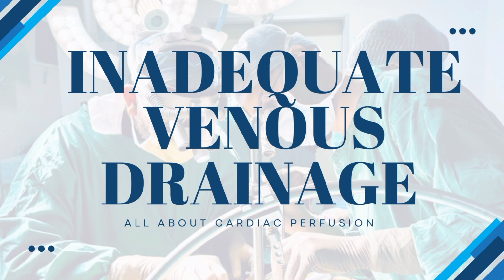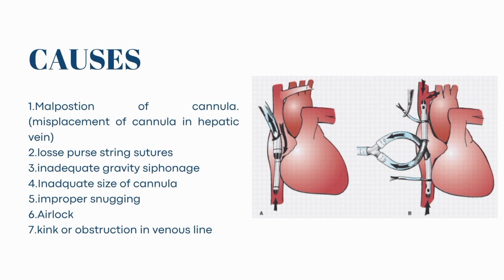When venous return is obstructed or insufficient, it directly affects tissue health. So we are going to see the causes and management. The first thing is malposition of the cannula.